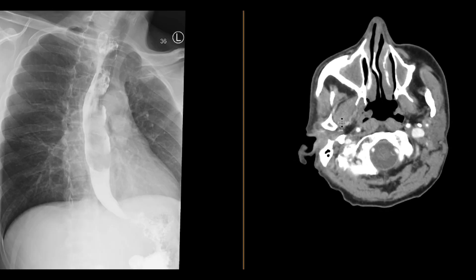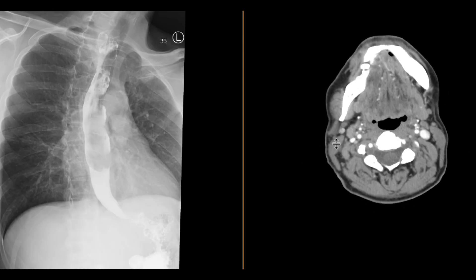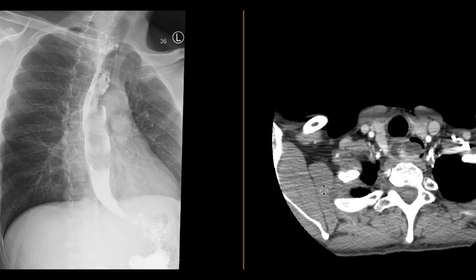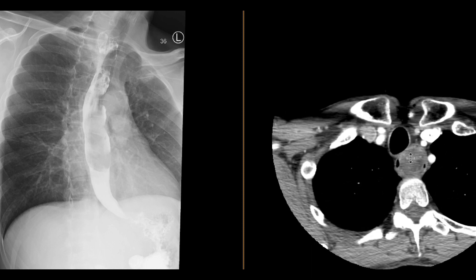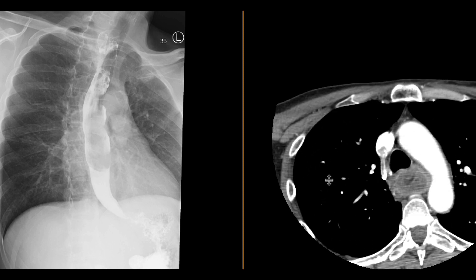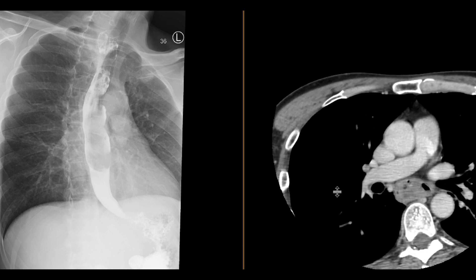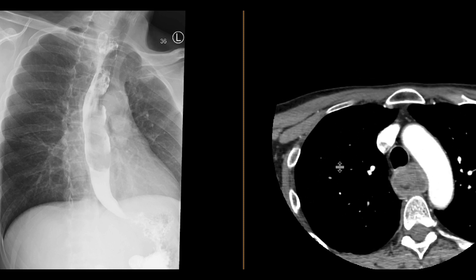This patient also had a CT scan. One of the imaging appearances described on cross-sectional imaging is that you may sometimes see foci of fat within this lesion. As you look at this lesion, it's quite large and occupying the esophagus, and you can see foci of fat within it. This was resected and indeed turned out to be an esophageal fibrovascular polyp.